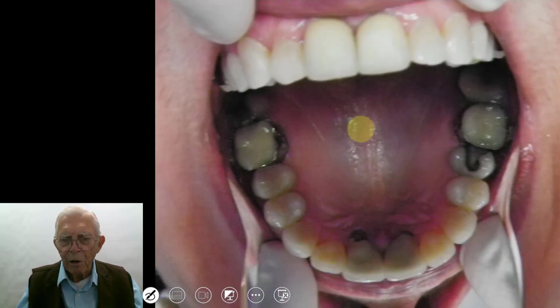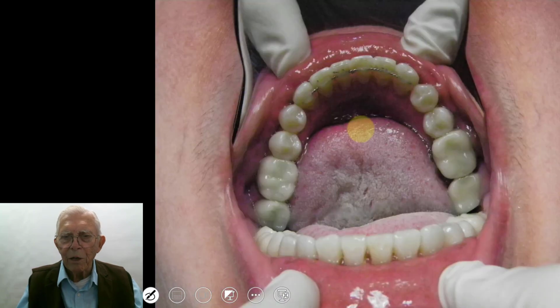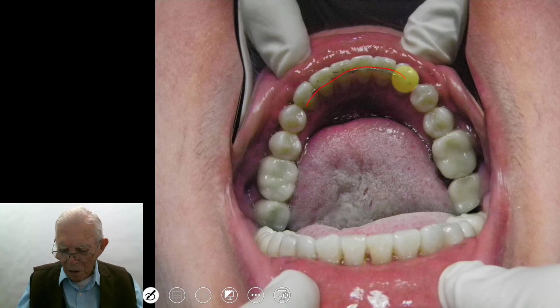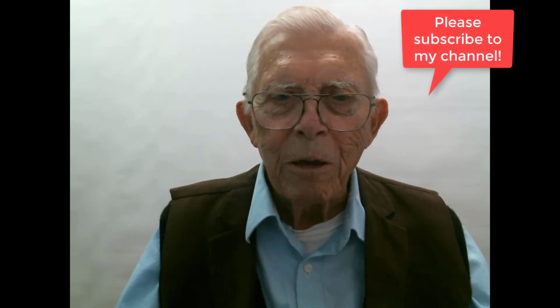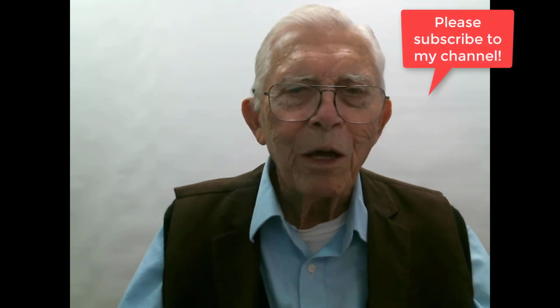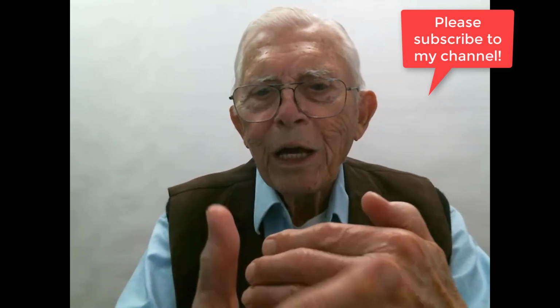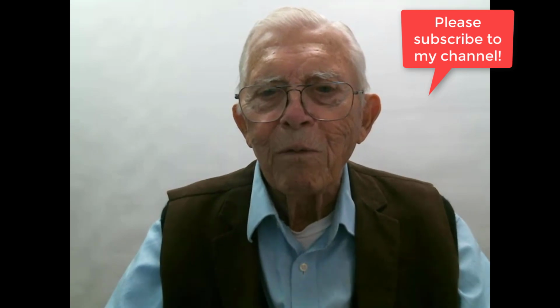And so here we are later on in the case, and you darn sure want to put a bonded retainer in here, and make sure they wear this thing or it'll shove it back. Now, this is not impossible to do, but you need to understand that you have to run interference so that the bone can grow as the teeth come forward.